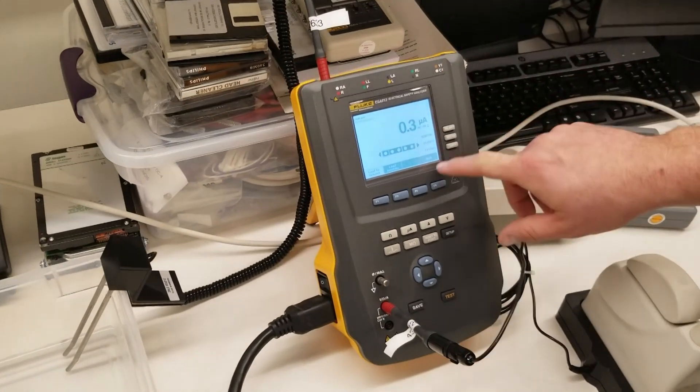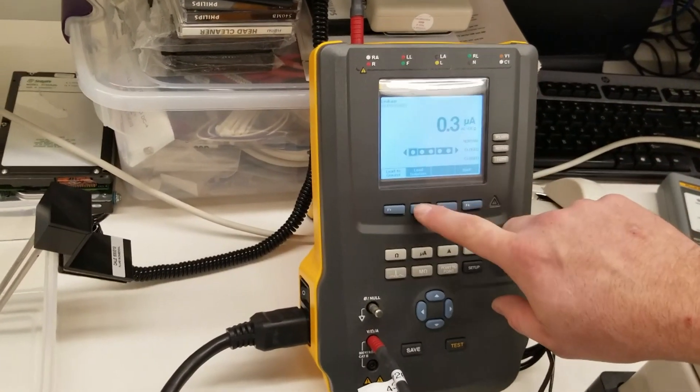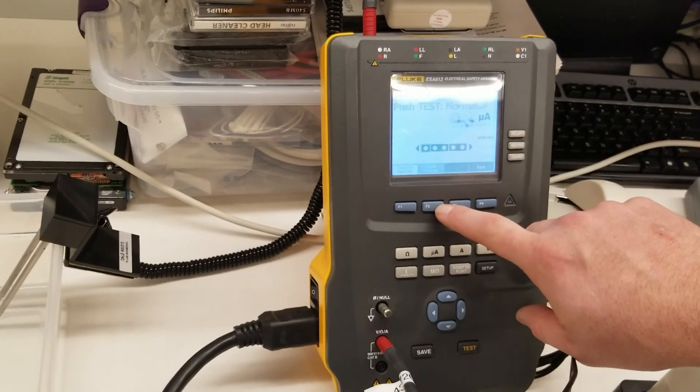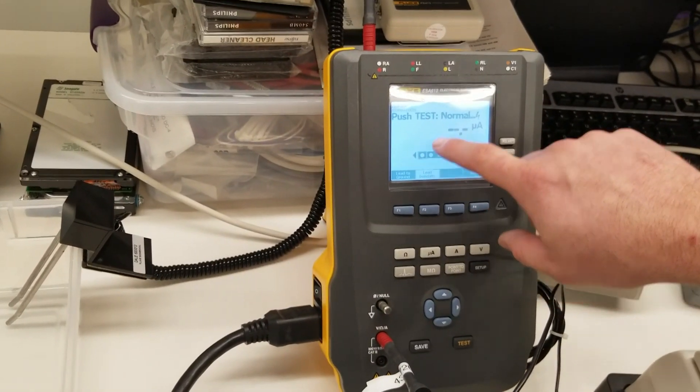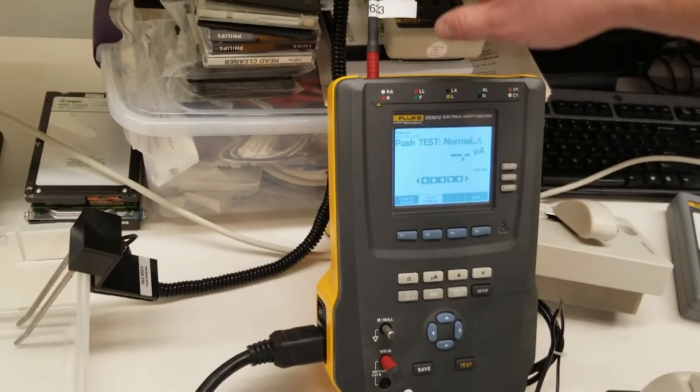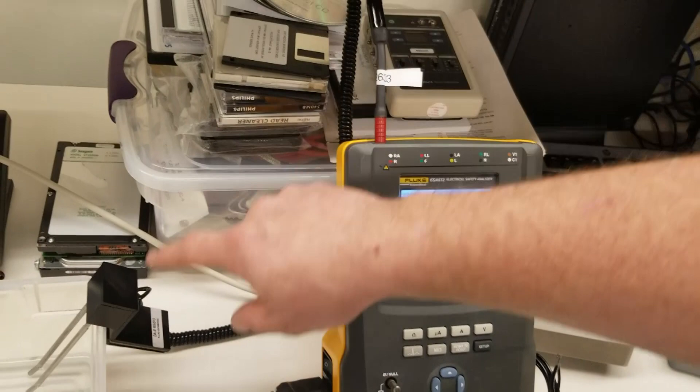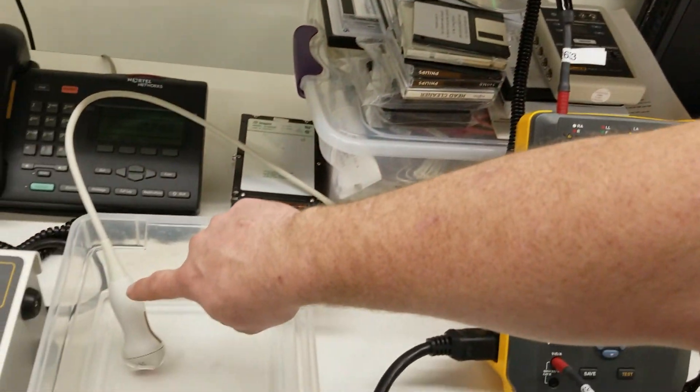we're going to go back to our ESA 612 and we're going to go to lead isolation test. Make sure we're going through the first port so our voltage is going to come out of the top through the probes and be picked up by the ultrasound.